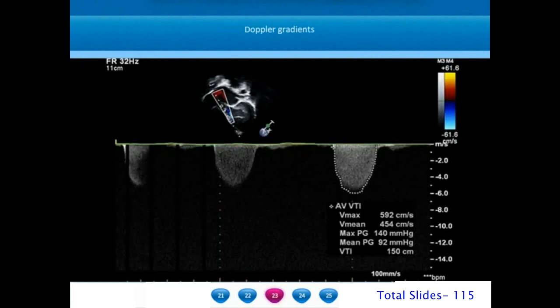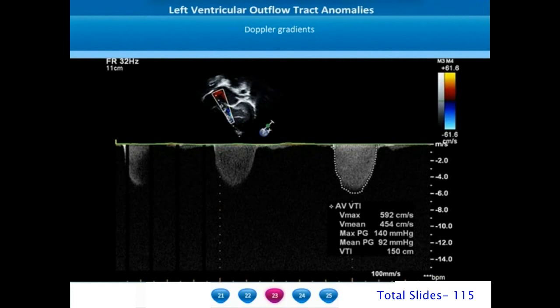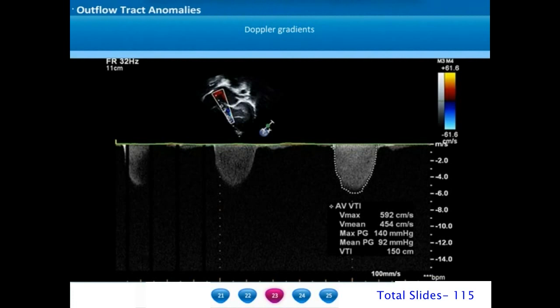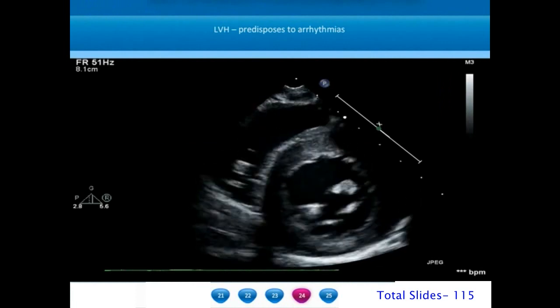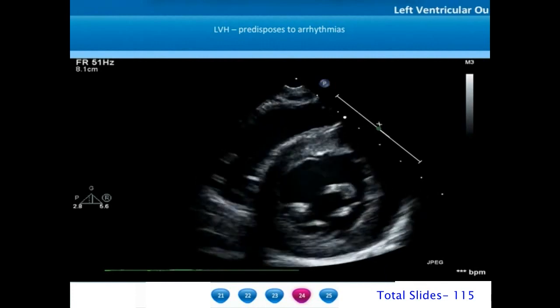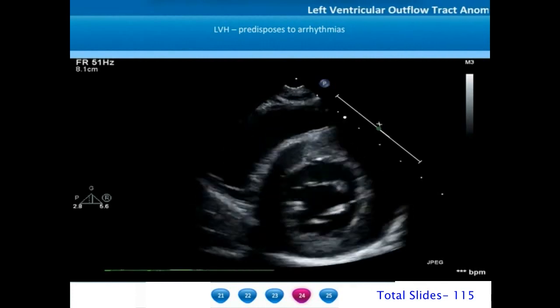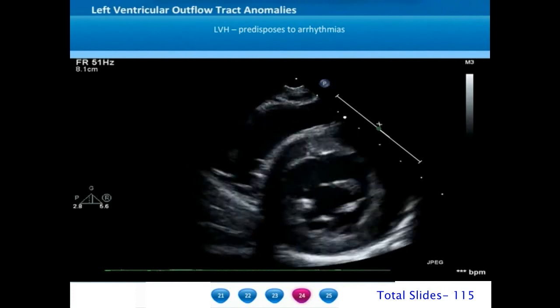High velocity gradients of aortic stenosis can only be measured by continuous wave Doppler. In this example, there is a mean gradient of 92 mmHg and peak gradient of 140 mmHg. Concentric left ventricular hypertrophy, a usual feature in patients with bicuspid aortic valve and aortic stenosis, is one of the predisposing factors for late onset arrhythmias in adulthood.